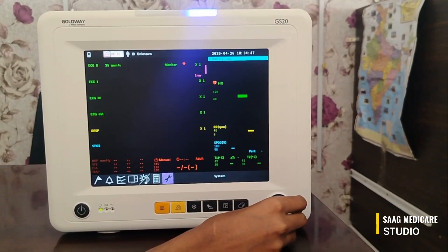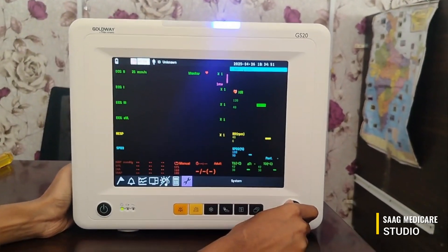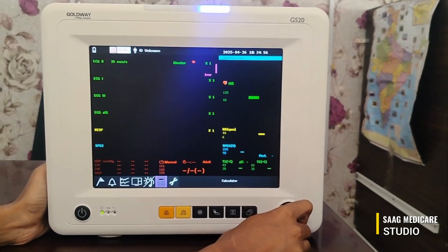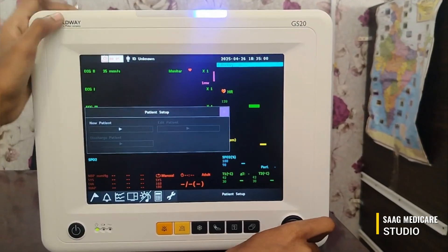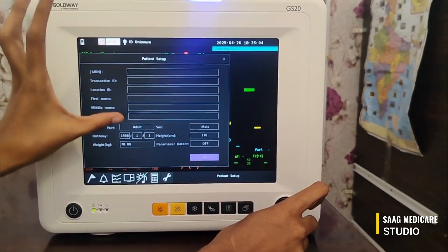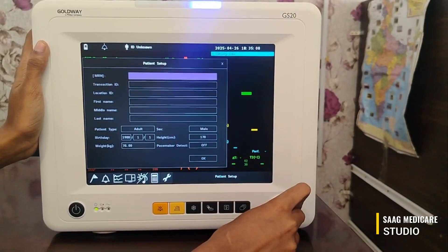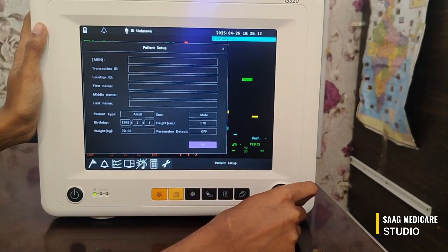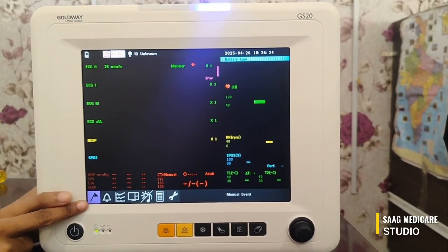This is the rotary switch for selecting menus — just rotate it to select any menu. To add a patient ID, rotate and select the ID option, then select new patient, and add the information. After adding the details, press the OK button to confirm.